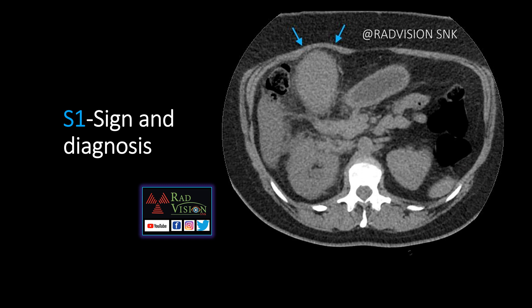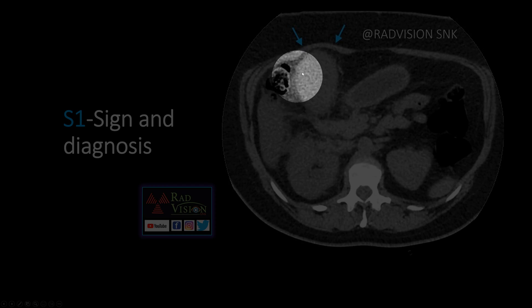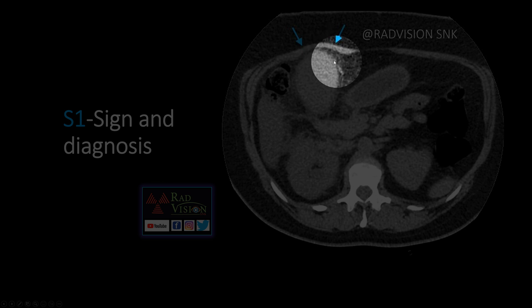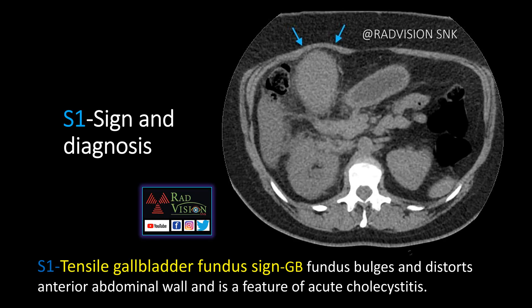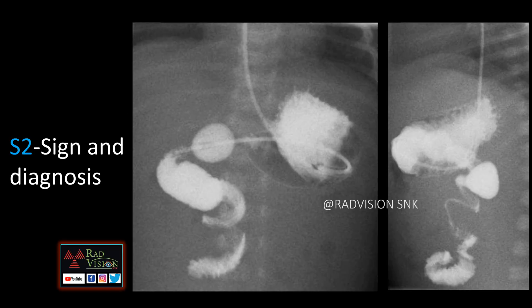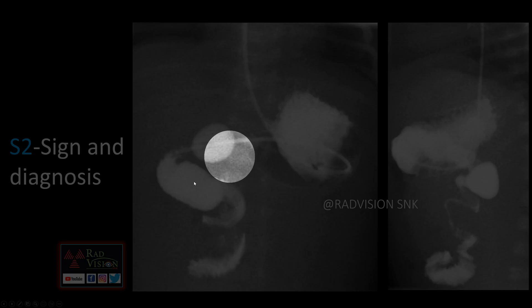Coming to the first case — here you can see the gallbladder, which is filled with sludge and is distended, causing indentation and displacement of the anterior abdominal wall. These arrows indicate the distension and displacement of the anterior abdominal wall. This is the typical tensile gallbladder fundus sign, where the gallbladder bulges and distorts the anterior abdominal wall, and it is a feature of acute cholecystitis. Remember: tensile gallbladder fundus sign in acute cholecystitis.